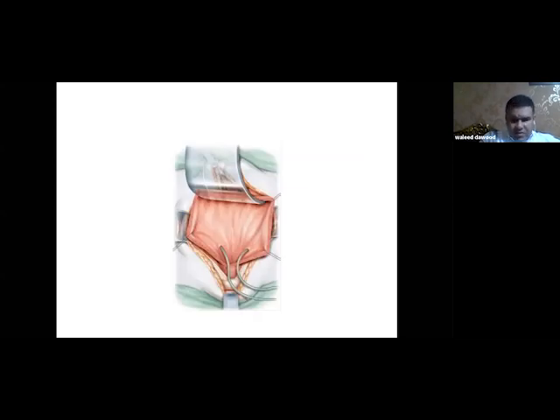As we see here, there is a knot of Vicryl suture at the apex of the lower part of the bladder incision to prevent disruption of this part and loose incision towards the bladder neck. Sometimes I take the suture from the sheath above the symphysis pubis, fix it to the bladder neck again and tie it over the rectus sheath to prevent disruption of the bladder.